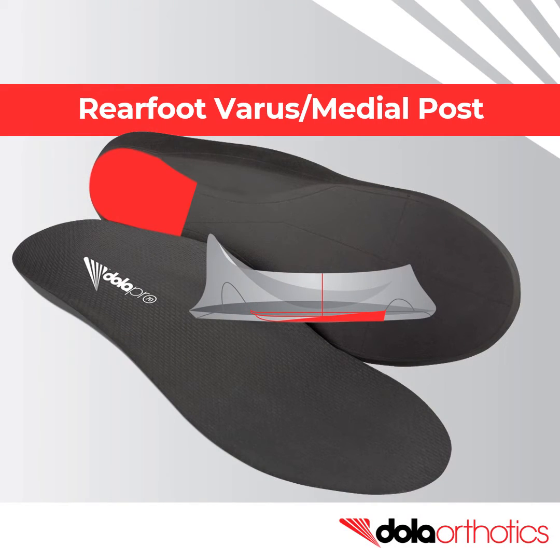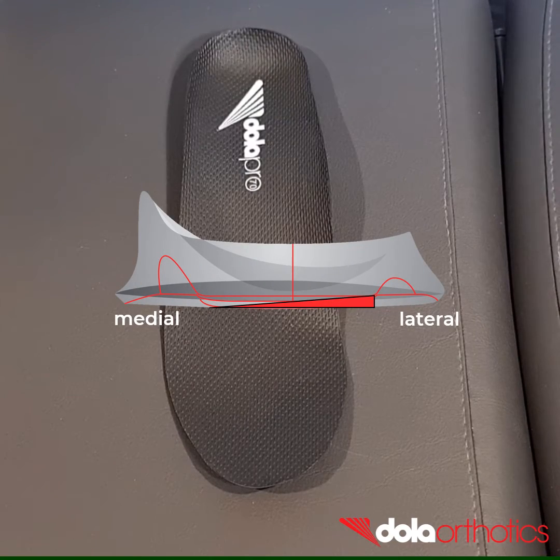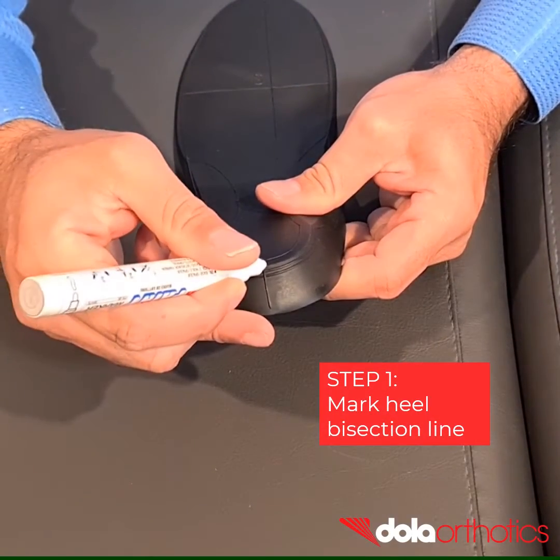The Rearfoot Varus or medial post intrinsic grind. In this video, we will show you how to complete a 6-degree intrinsic Rearfoot Varus grind on a full-length DOLA orthotic. Step 1. Mark the heel bisection line.